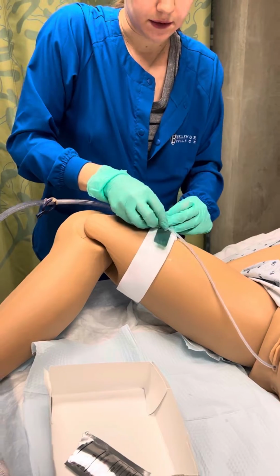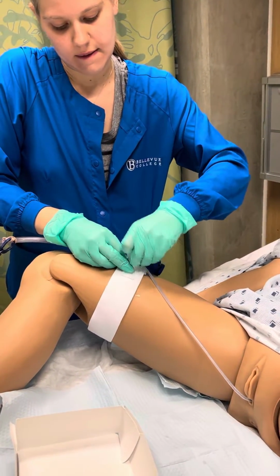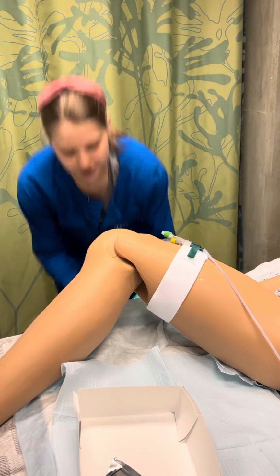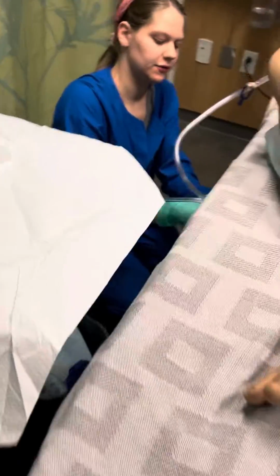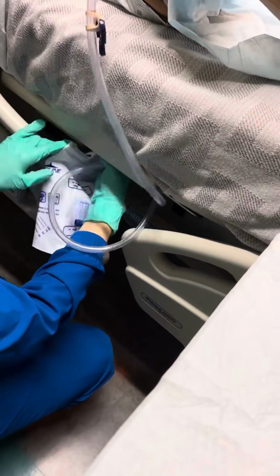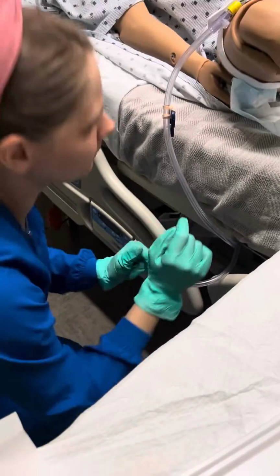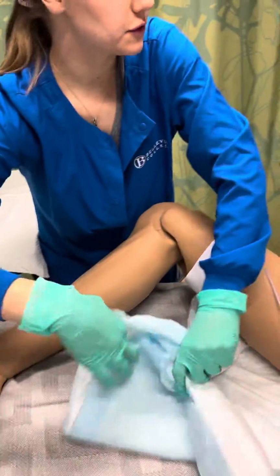And I secure the catheter to the thigh. And attach the bag. Not to the handrail, but to the actual metal attachment meant for the catheter bag. And everything is non-sterile. I'm going to remove all of my trash and lift your hips for me.